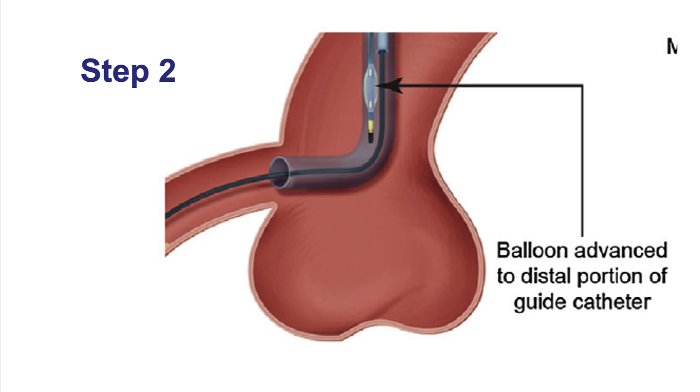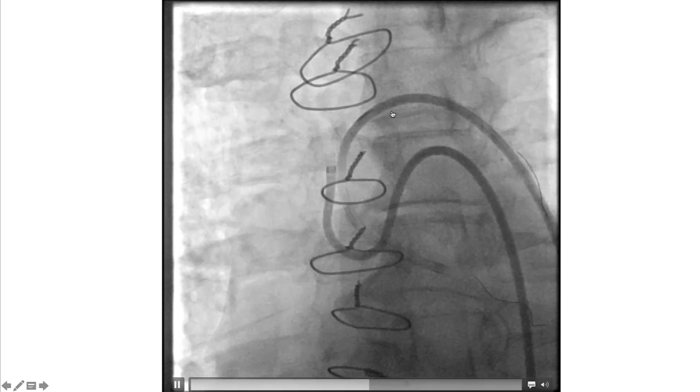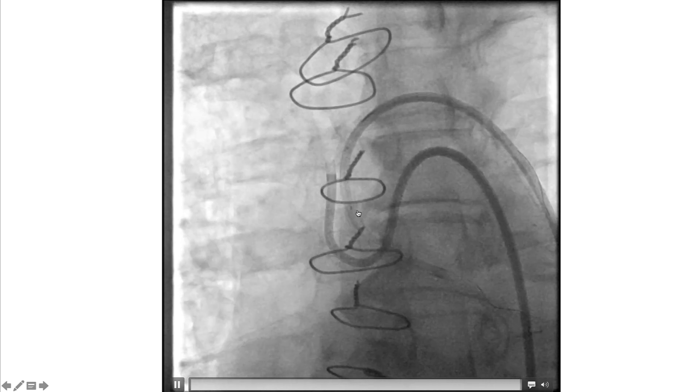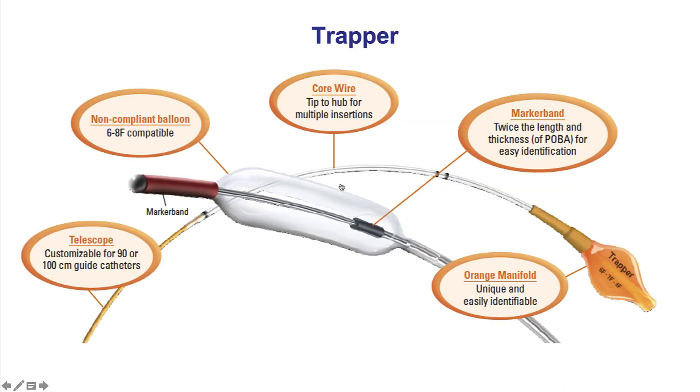Balloons are typically inflated at 15 to 20 atmospheres. The balloon is advanced without a guide wire, so it is very important not to let it exit from the tip of the guide catheter, as this could cause vessel injury. There are also dedicated trapping balloons, such as the trapper balloon. The trapper balloon does not have a wire lumen, which is why it must not advance through the tip of the guide catheter. There is a stopping mechanism to prevent that, but because some guides can be short, it is important to monitor the position of the trapper balloon.